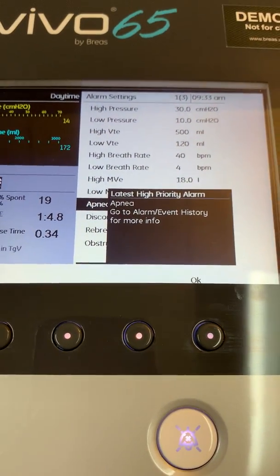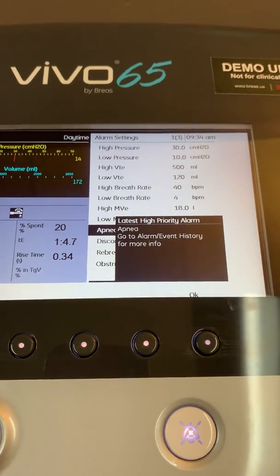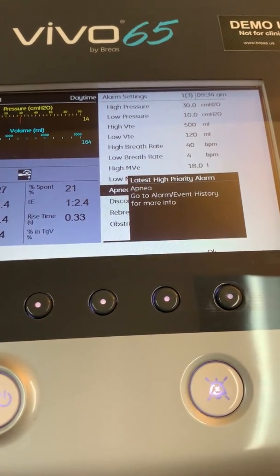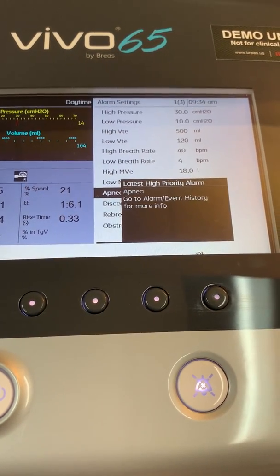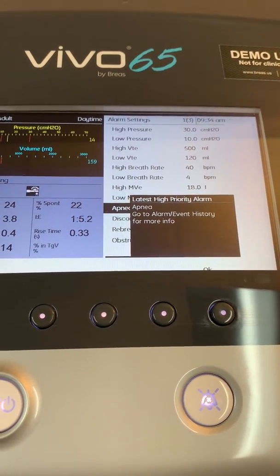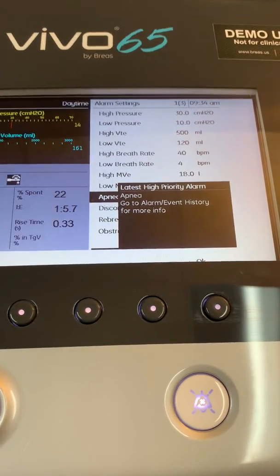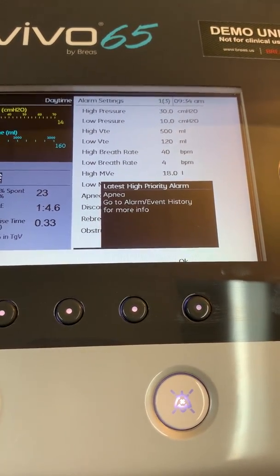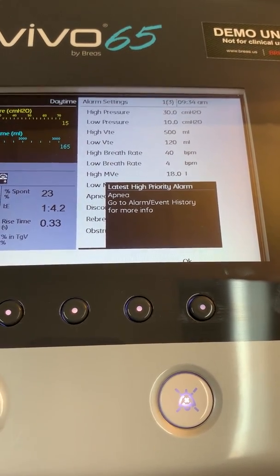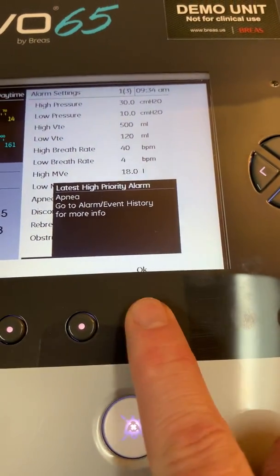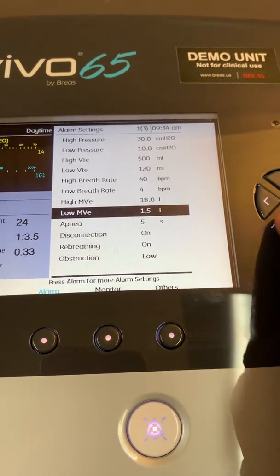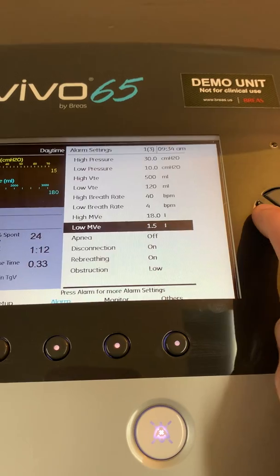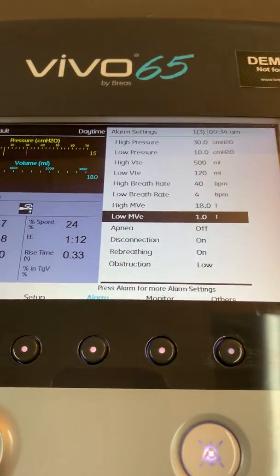If you had more than one alarm go off, you will have a message here stating that an alarm did go off and was reset. If you want to check when that alarm occurred, you can look in the alarm and event history for more information. I'm going to clear that away, highlight the apnea alarm, turn that off, and move on to the next one.